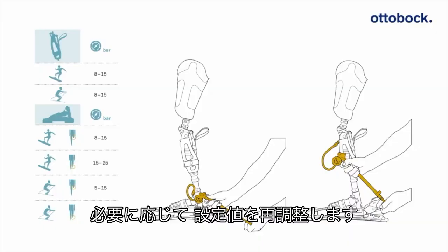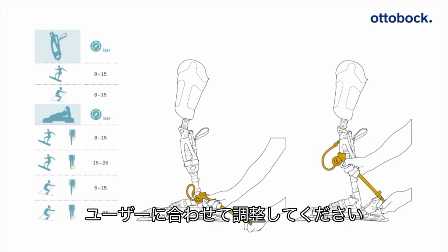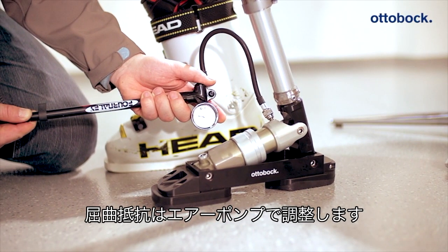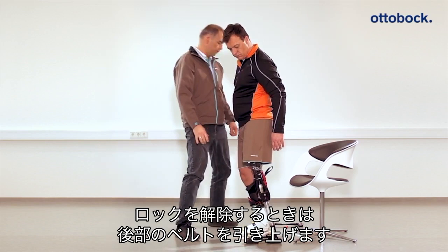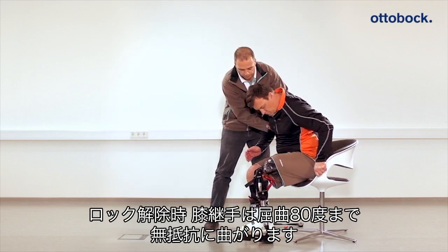Note that these are merely basic values that need to be individually adapted for every athlete. For adjusting the hydropneumatic system, the extension resistance can be adjusted with an Allen key, and the flexion resistance can be adjusted with the help of the high-pressure air pump. The knee joint is unlocked simply by pulling on the attached belt, which increases the flexion angle up to 80 degrees without any resistance from the damper.